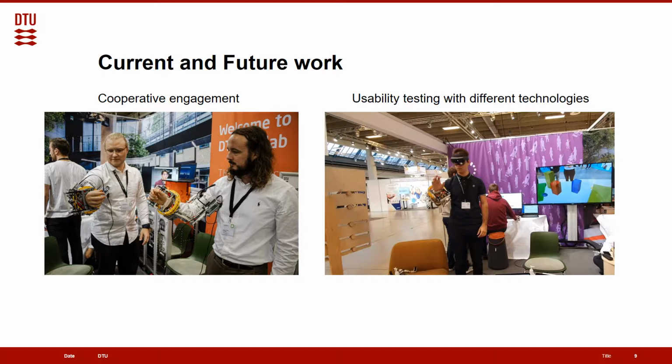In the future, we will investigate how to integrate multiple sensors such as EMG and GSR, and fuse the data from other sensors such as eye tracking to provide a more robust control interface for serious games. This will provide adaptability of an exoskeleton to different disabilities afflicting people with stroke and other neurological diseases.